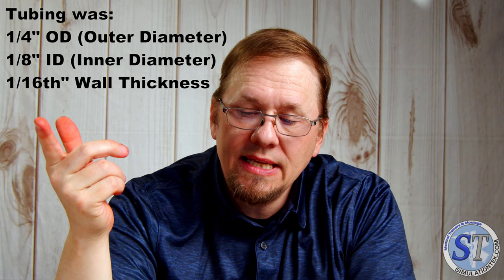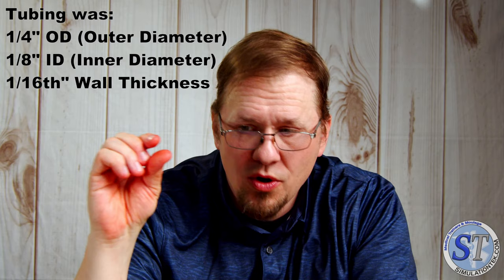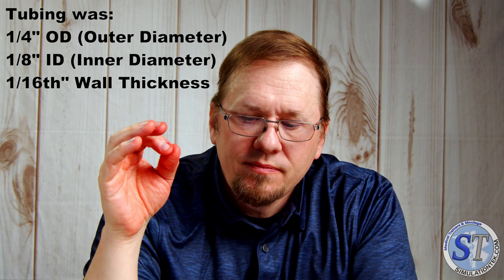Make sure you're putting these back in a bag of some sort. For this one, what I got was 1/8 inch, 1/16, 1/4. What that means is the outer diameter of the tubing is 1/4, which is about what this is, I believe. I'd have to actually measure it. It's 1/16th wall, I believe.